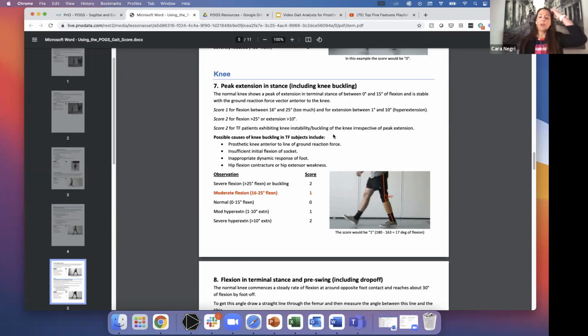In our clinic, I decided to start with transfemoral patients as my first cohort for working video analysis into our practice, mostly because these are our patients that have the most mobility risk and fall risk, and there's usually a lot more going on. So we find more value in it, both in how we prepare for that intervention and in how we talk to the physician and the physical therapist about what's going on. That's where we're going to start.